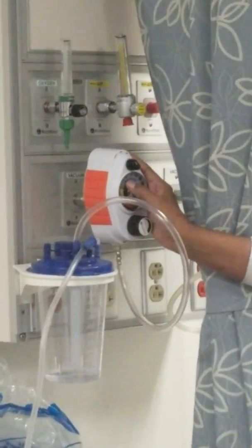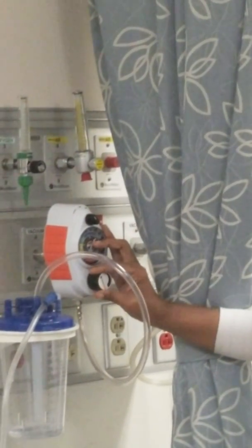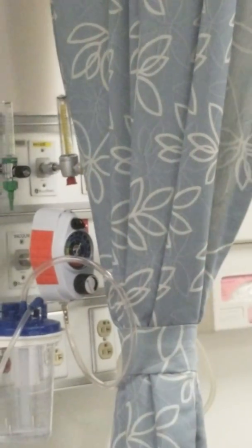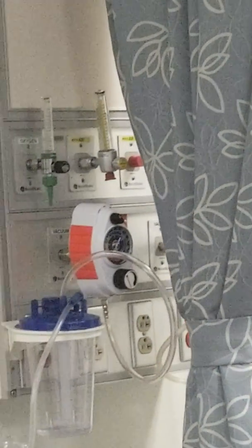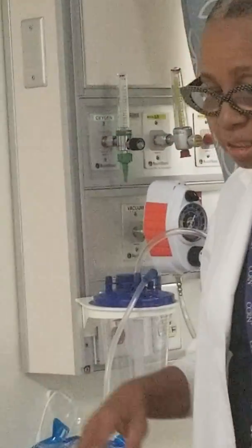And you can see my choices are 100 to 125. So once I turn it on, I need to dial it so it rests between there and I have the proper amount of suction. Okay, y'all feel better already, huh? Then I would test my suction just to see if it's working.